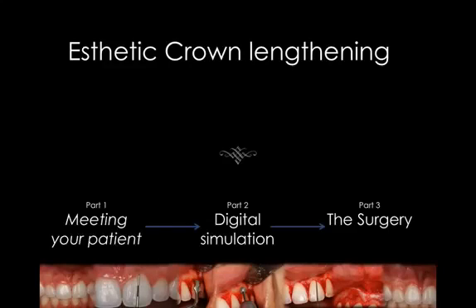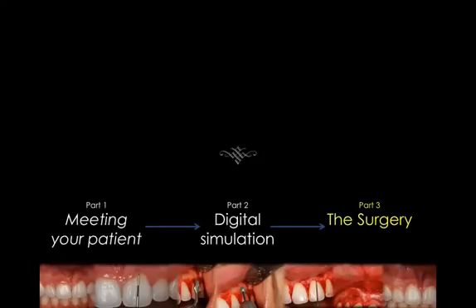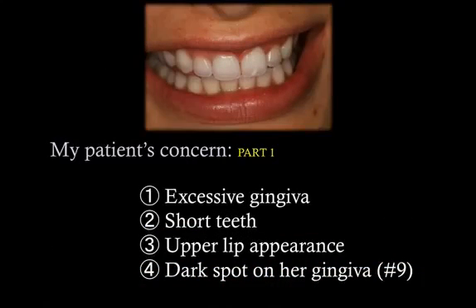In this video, I'm going to talk about the actual surgery step by step and how it works and what the challenges were. And you'll get a good idea how to perform this in your own practice with your own patients. Now, our patient had a few concerns.